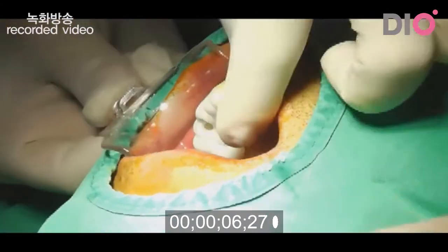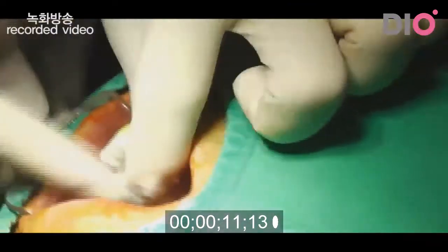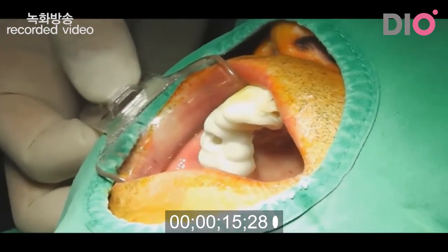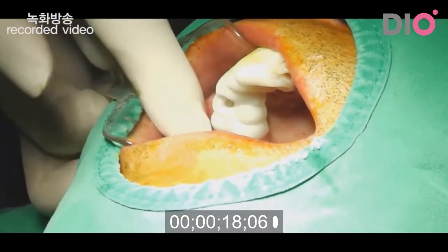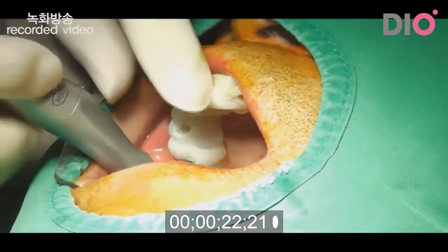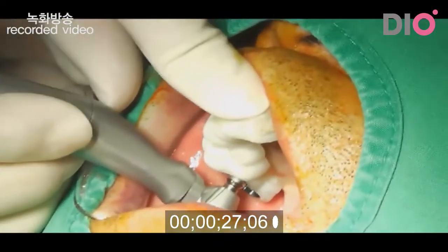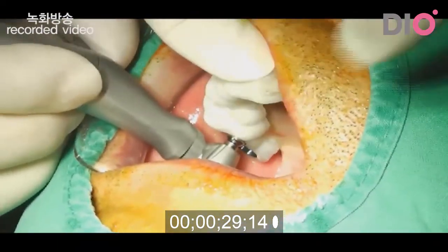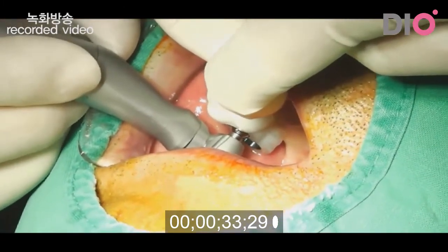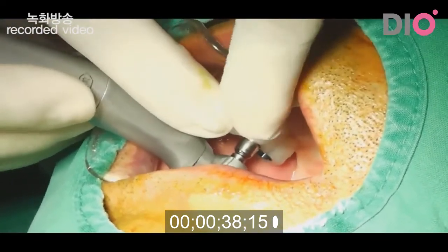So the surgical guide is inserted, and the surgical guide is very secure in position, and then I will start drilling. The first drill is a tissue punch. I will use this tissue punch to punch out the core of mucosa. And just drill until the tissue punch touches the bone.